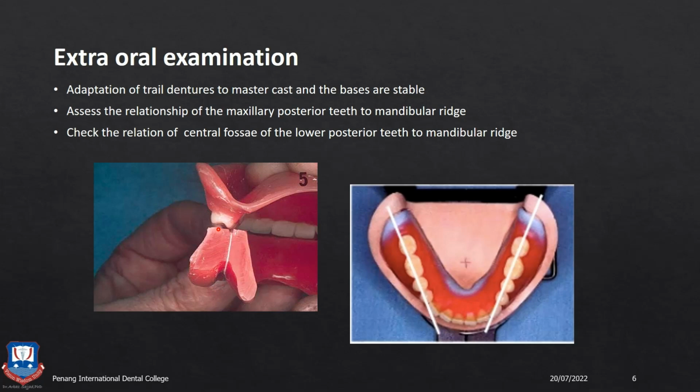All these things, and the proper sculpting of the wax, whether it is smooth, whether the cameo surface and the intaglio surface meet each other smoothly. It should meet like a fish belly.